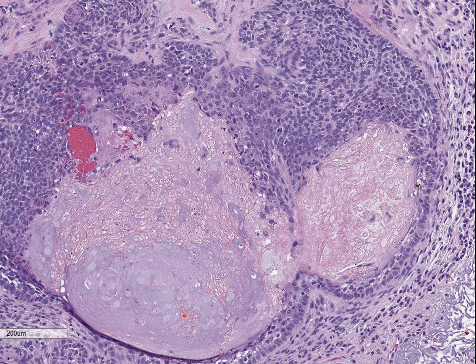Another BCC with adnexal differentiation, and in this case, you see islands of shadow cells indicative of hair matrix differentiation. So this is a BCC with matrical differentiation.